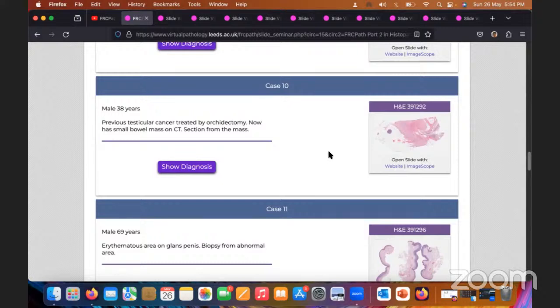Okay. So, Dr. Supraditi has asked, are we expected to differentiate between varicella zoster and herpes simplex virus by histology? You should give that I favor varicella zoster because I find some histological clues, like there is follicular involvement, there is leukocytoclastic vasculitis, because you know the 3M and the blister are similar for both HSV as well as varicella. Only the associated inflammation is more in case of varicella zoster, and in herpes simplex you will not get any follicular involvement.